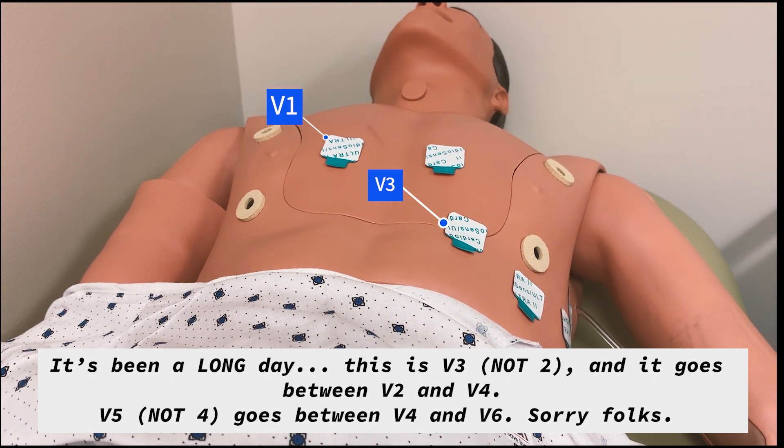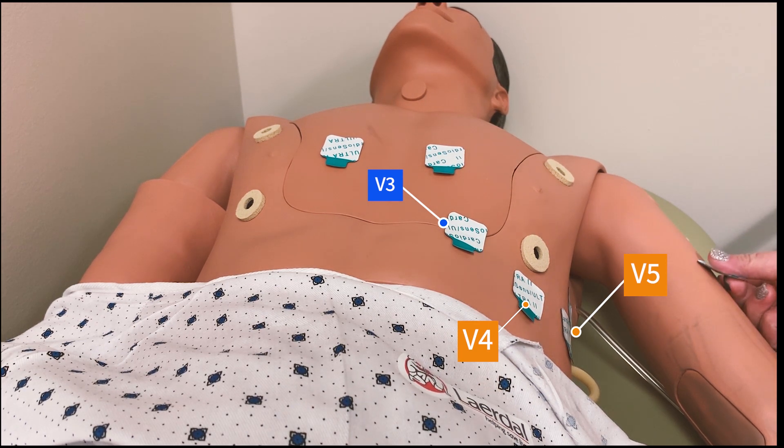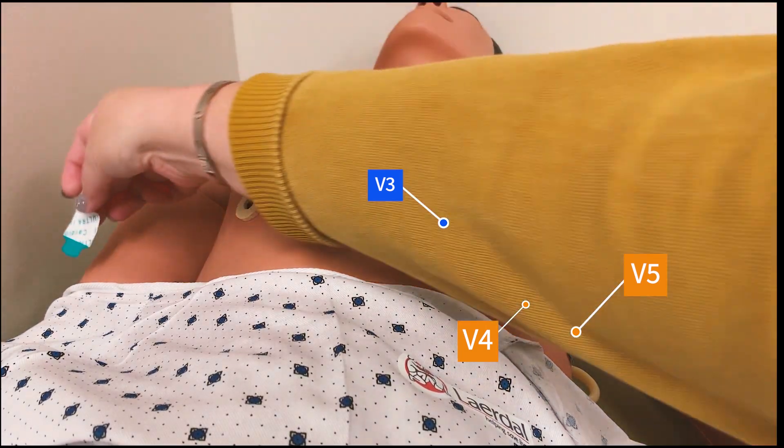So we've got all of those lined up, and then we need to put one lead on each arm. Again, you want to avoid a bone — it's better to put it on a place with a little bit of tissue. Some providers want them on the inside of the arms, some on the outside. I prefer to put them on the outside of the arms.